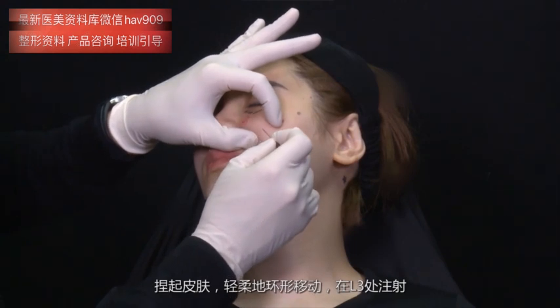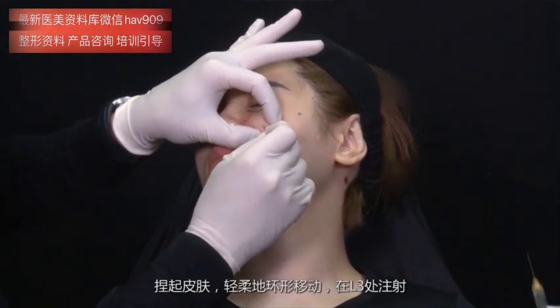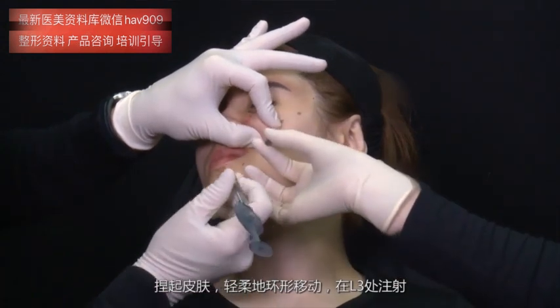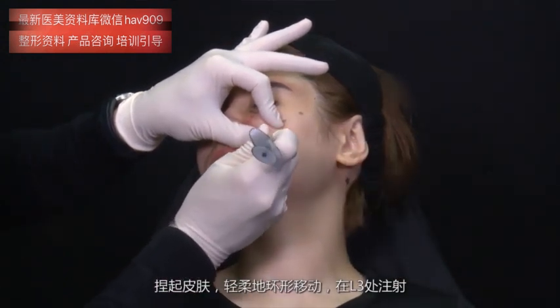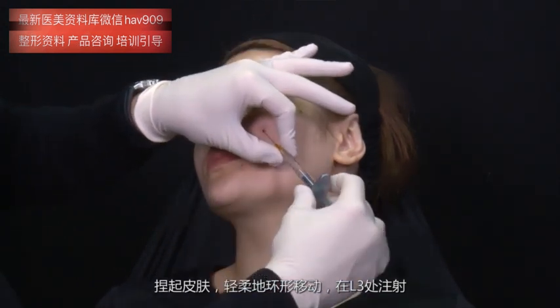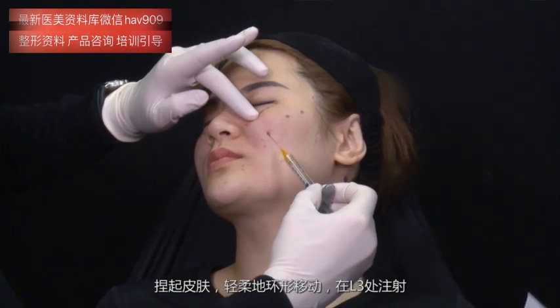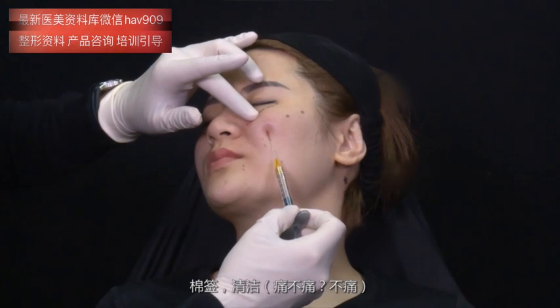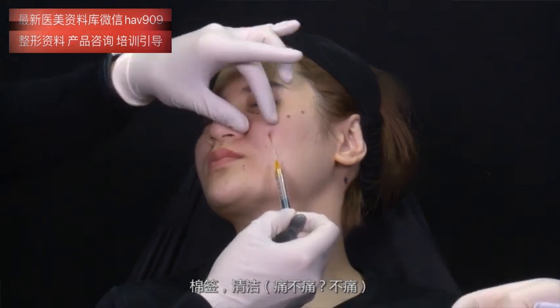Pinch and slightly with a circle movement, let's inject in L3. Sterile. Get the cotton bud, sterile.